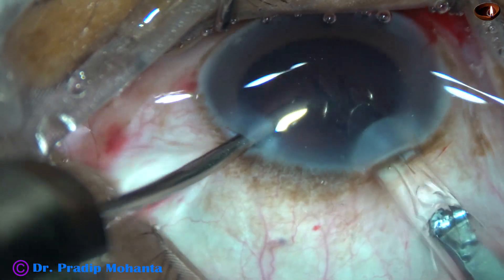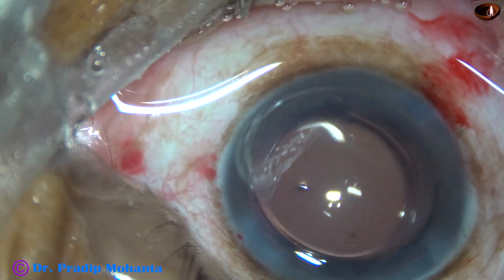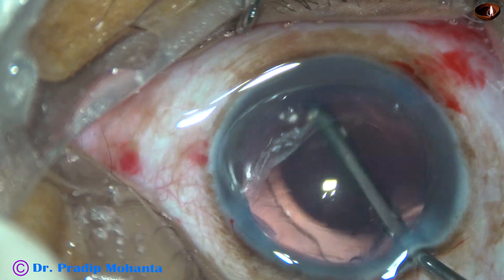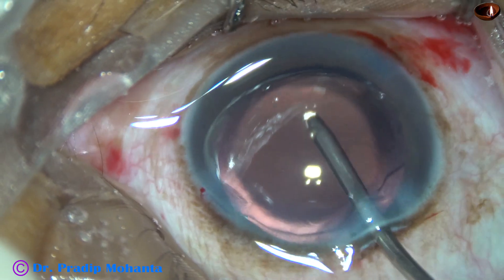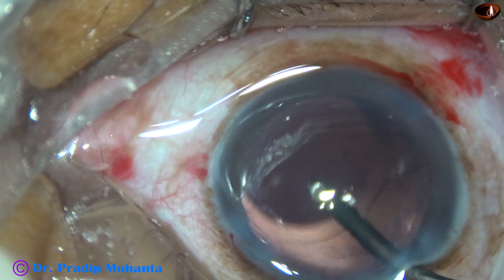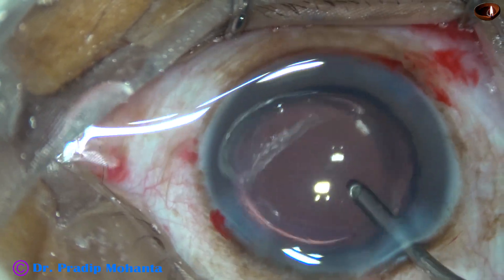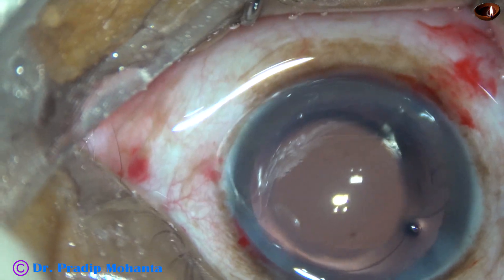This is hydro-implantation of a single-piece monofocal intraocular lens. The lens has gone into the capsular bag. The haptics are at the equator of the capsular bag and the lens is nicely centered. Now this is irrigation of the anterior chamber to remove any visco that was in the lumen of the cartridge.